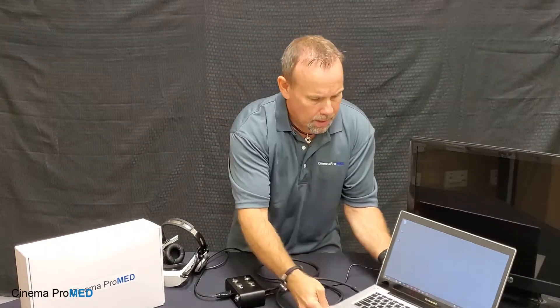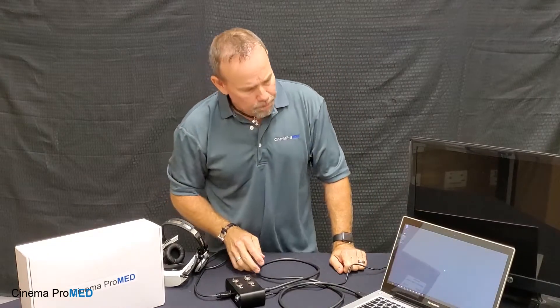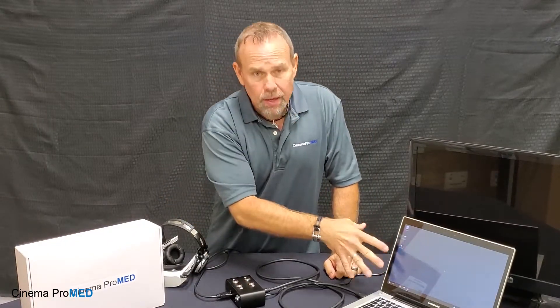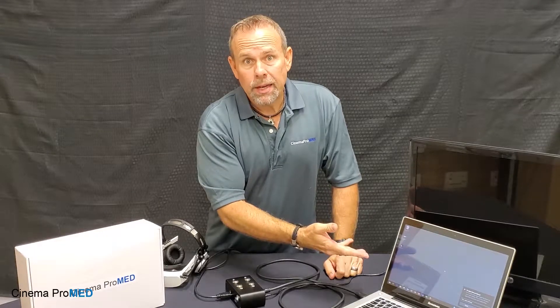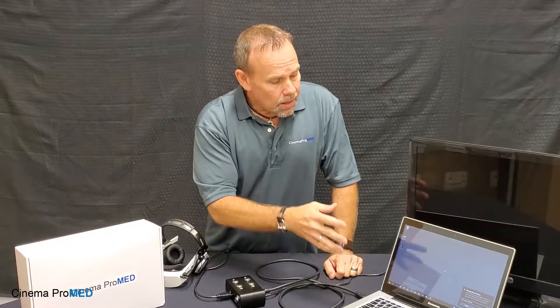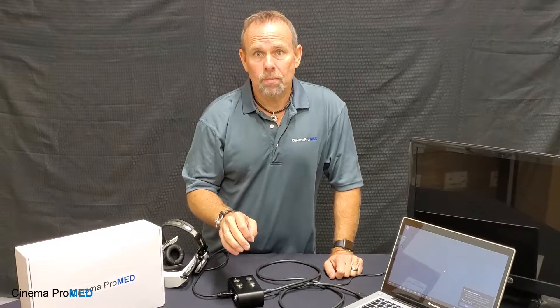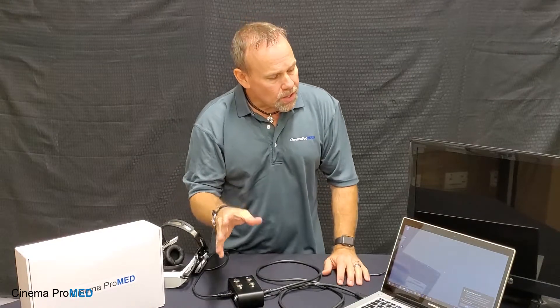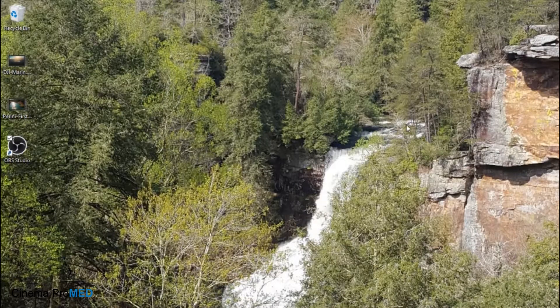Now we need to go into the computer and get the right settings. The Cinema ProMED video goggles require a 720p connection, meaning 1280 pixels wide by 720 pixels tall, at 60 Hz. The next step is to go into the computer and show you how to change your settings to 720p.